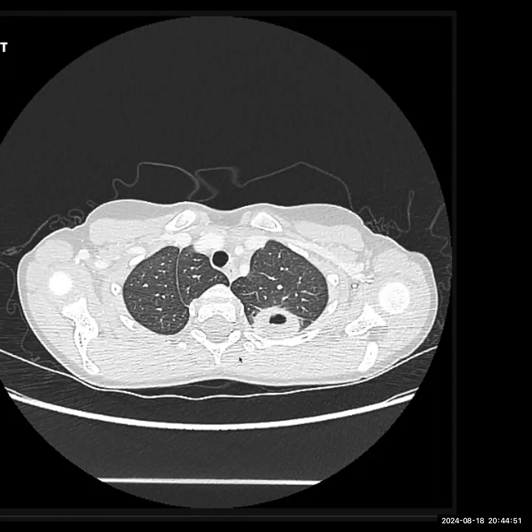What it gives is a picture that you have a good base of the differentials and what you are expecting, rather than letting the examiners ask you, if it was cavitating, what would you think? If you were saying it's a cavitating lung mass, if I were in your place, I would have said that if I were to consider this as cavitating lung mets, I would have thought about head and neck tumors like squamous cell carcinomas or urothelial carcinoma of the bladder and all the other differentials you said, rather than me asking you, if it is this, what are you thinking? So please try to finish off all your differentials in a conditional differential diagnosis way.